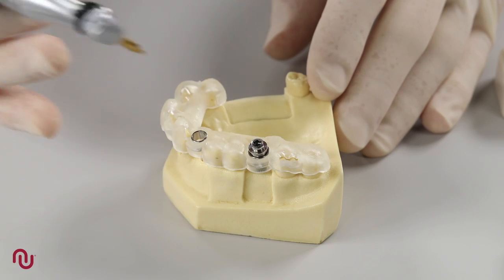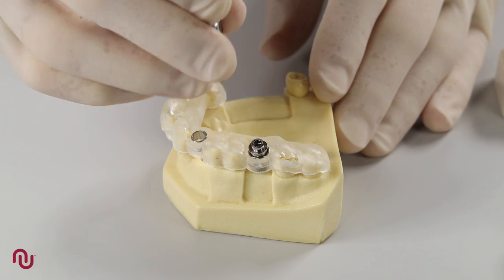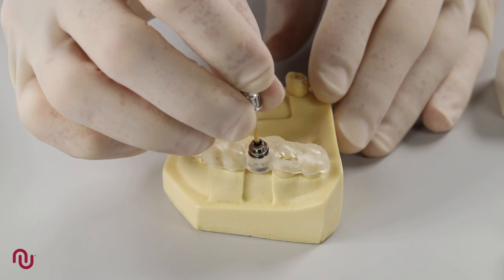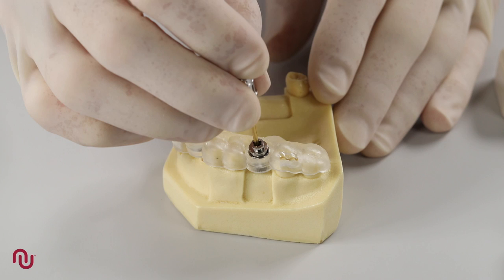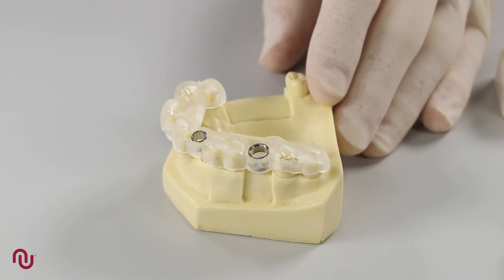We then disengage the inserter, and once all implants are inserted, unscrew all implant mounts before removing the guide. Following placement, remove the surgical guide and attach either a healing abutment or provisional prosthesis.